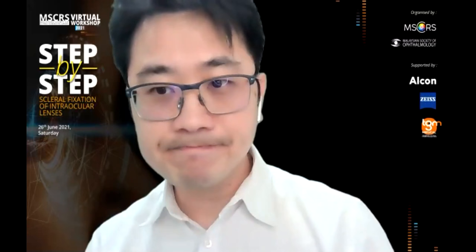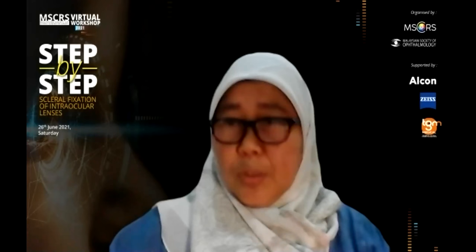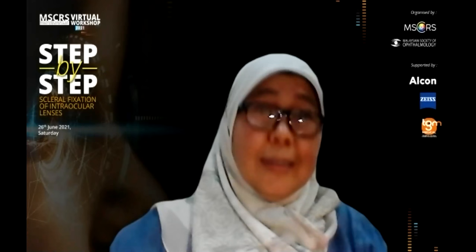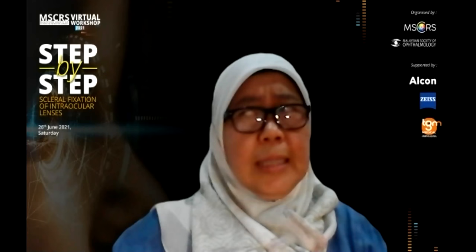Actually, the first question, Dr. Raja, can I know what lens you were using in the last video? Oh, the last one, yeah, there's one question actually for that. The last is a foldable scleral fixator by Moshe, model 90L. It's foldable, but it is a hydrophilic lens.